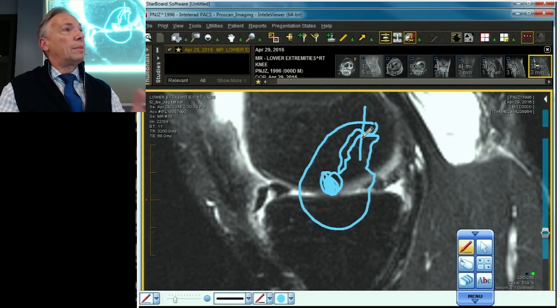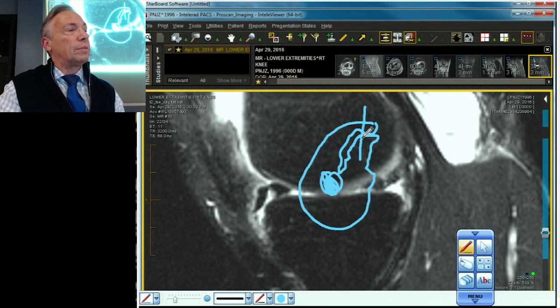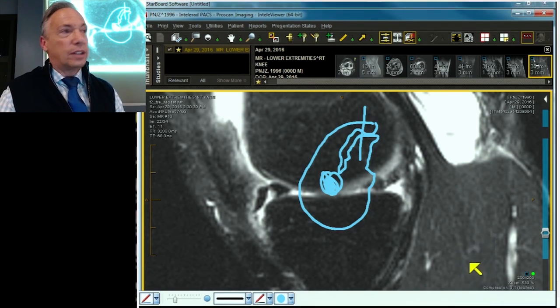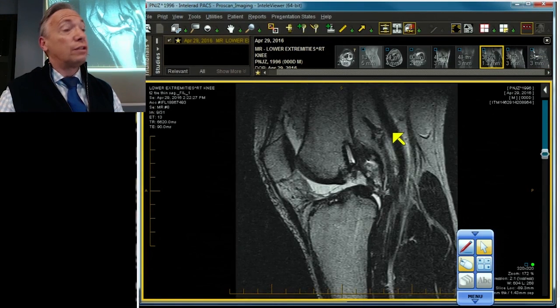The bucket fragment can twist and migrate, but when it migrates it usually does so anteriorly. The classic bucket will go underneath the posterior cruciate ligament. It's important to assess the rim thickness and whether the fragment you're trying to sew to itself also has a tear. One final caveat: people that get bucket handle tears usually have some form of knee laxity — the most common form being ACL deficiency.